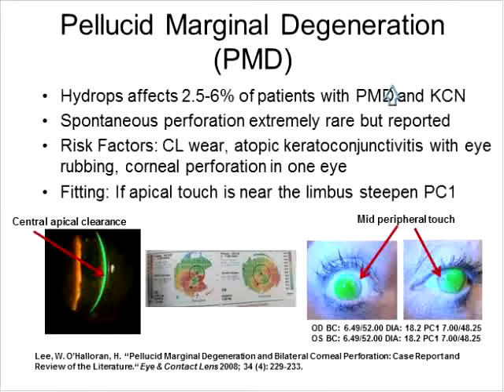Okay, here's a really good question. What is the acceptable amount of microns regarding a tear reservoir, especially in a dry eye patient? Is it better to have more than less? Why don't, Melissa, why don't you start out with that, and then we'll see if Mindy or Lynette has a comment.